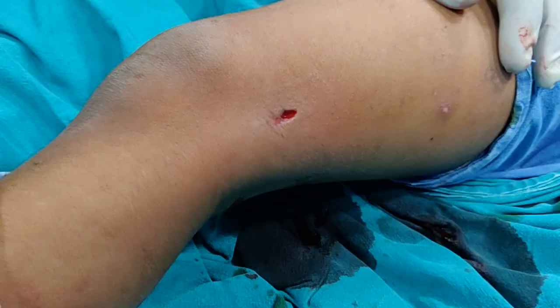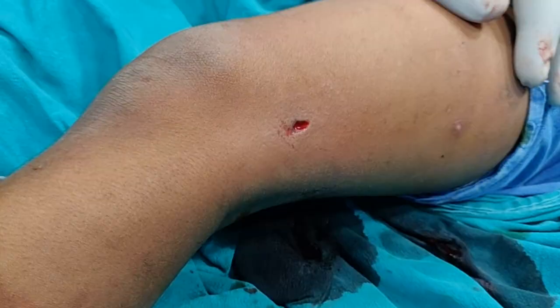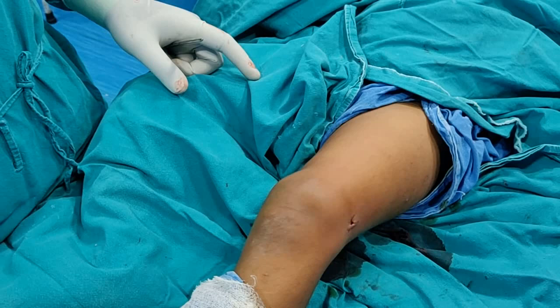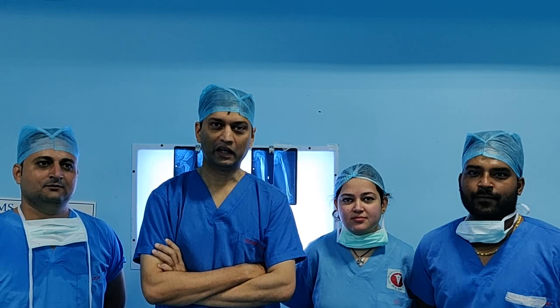This surgery is so fascinating — you can do this operation through just a small hole in the skin. All you require is one incision and one stitch on the lateral aspect and one stitch on the medial aspect. There is no need to immobilize in any cast, and the patient can start bending the knee straight away. This was a surgical video of TENS nailing — one of my favorite operations. Thank you to the team: Dr. Rashid who performed the operation, Dr. Saurab who assisted, and Dr. Chandni who was the anesthetist.